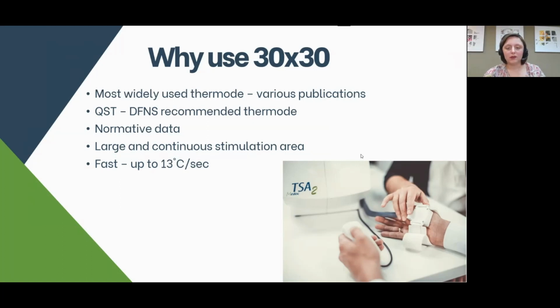Why use the 30 by 30 with your TSA2 device? First of all, as I already mentioned, this is the most widely used thermode, and there is a lot of data out there published with this thermode size, including normative data for different body sites and different areas, which you can rely on, which is quite important.